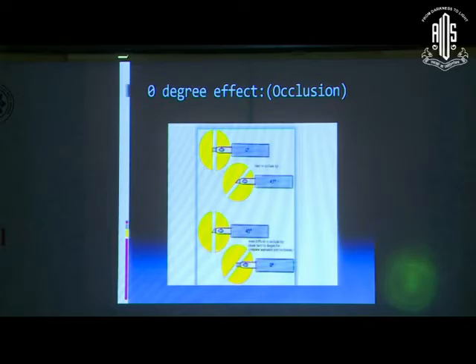But the same can be achieved by a 45-degree tip if the pieces are oblique. But in a vertical piece, if you apply a 45-degree tip at 90 degrees, you won't get a good hold. And again, for a 0-degree tip also, if the pieces are oblique, you are not going to get a very good hold because there is no 0-degree effect. For any piece, you can get a 0-degree effect by aligning the surface of the tip to 90 degrees to the nuclear pieces.